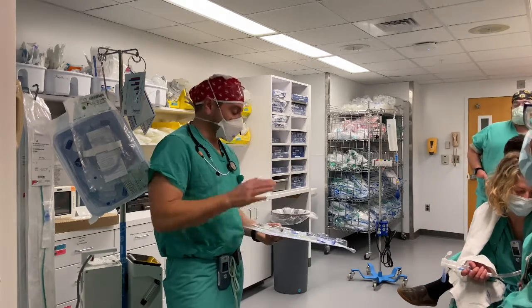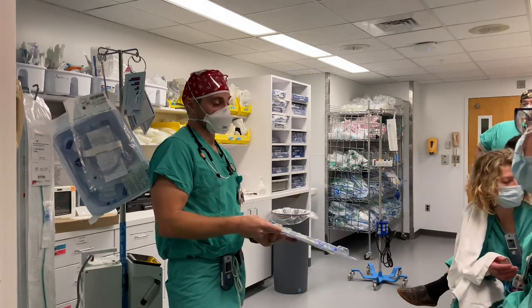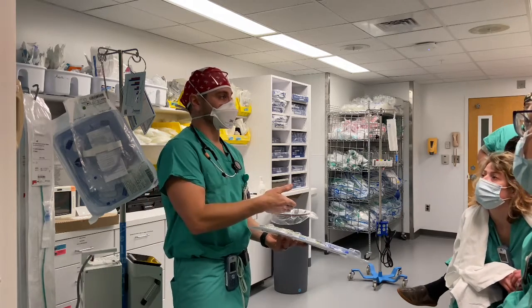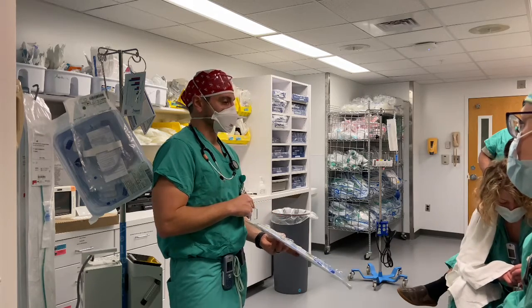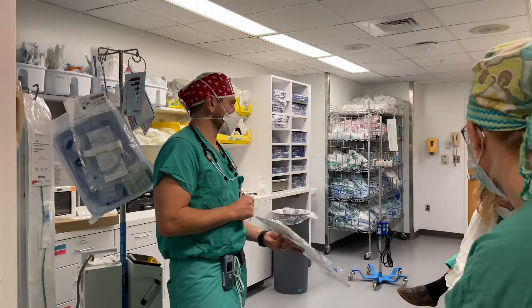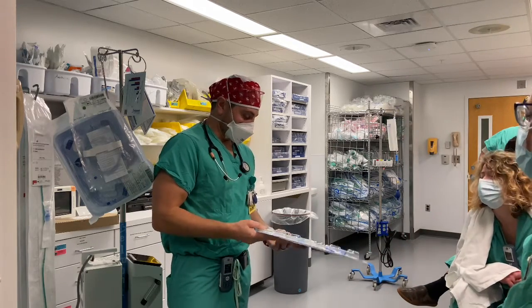So in adults, it's mostly because we don't want to exchange the tube at the end because we're worried about losing the airway, or up front because it's a difficult airway and we don't think we're going to be able to get a double lumen tube in. Those are probably the two most common reasons why we use a blocker over a double lumen tube. Again, people don't use these very often.